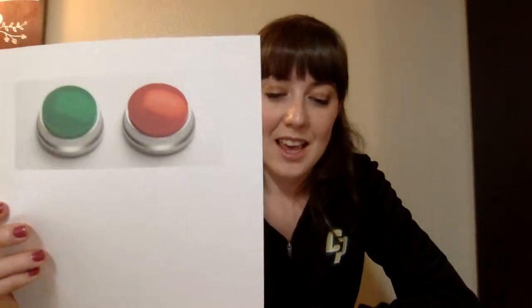And now I'm going to move into the actual treatment for anomia. So you're going to want to explain to your client the explicit directions before beginning your treatment. So for this task, the client is going to determine if the displayed picture matches the subsequent spoken word. If it does match, they're going to go ahead and push this green button. If the picture and the subsequent spoken word do not match, they will go ahead and push this red button.